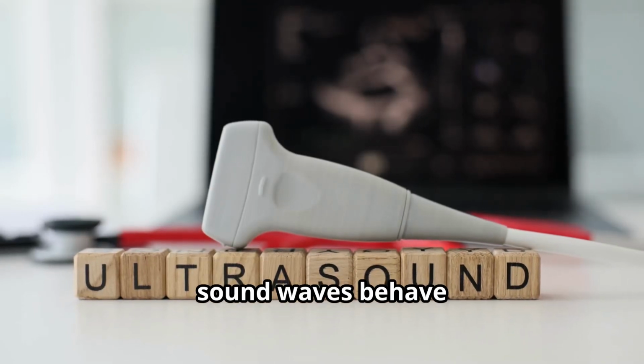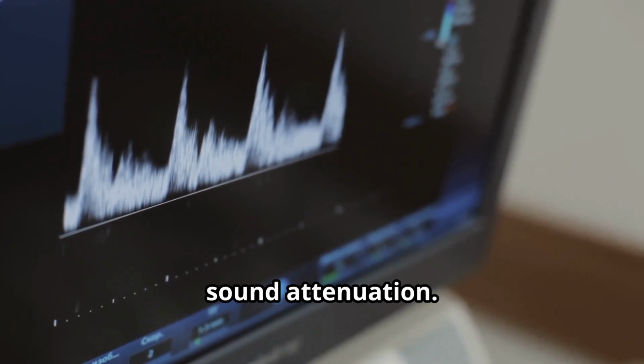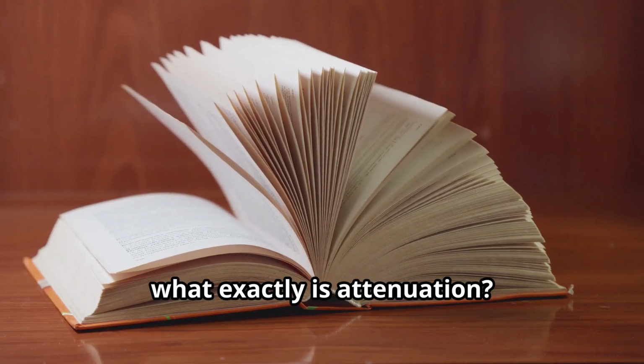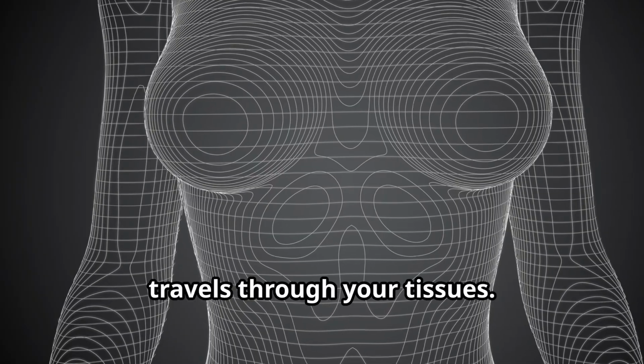Ever wondered how sound waves behave inside your body during an ultrasound? Let's break down sound attenuation. So, what exactly is attenuation? Simply put, it's how sound loses energy as it travels through your tissues.